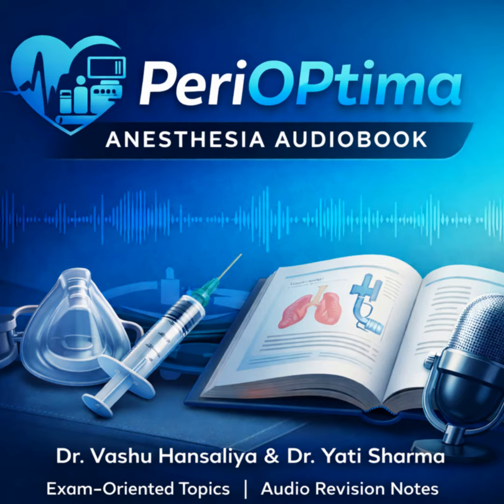And finally, a limitation trainees often overlook. Resources and expertise. You need a skilled, calm operator. This is not a technique to be attempted by a novice in an emergency. And you need the equipment, the scope, light source, everything to be functional and ready. This brings us right to the heart of that 20-mark essay, preparation for awake fiberoptic intubation.